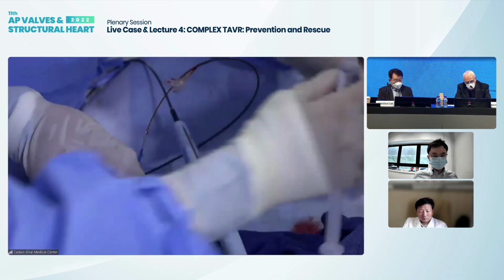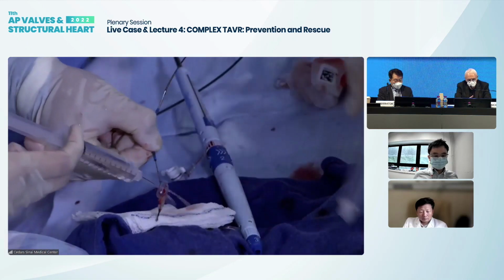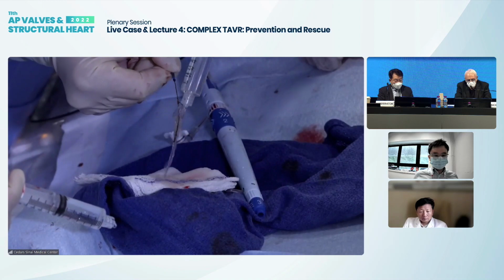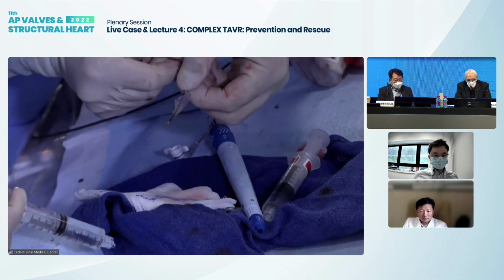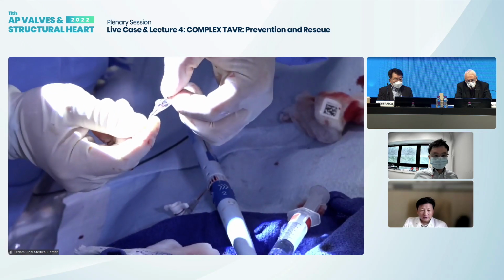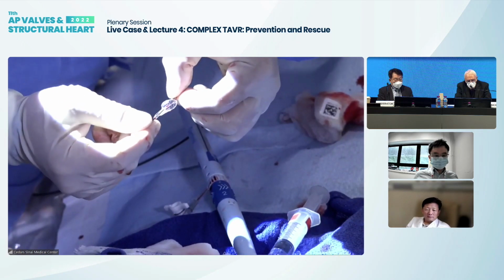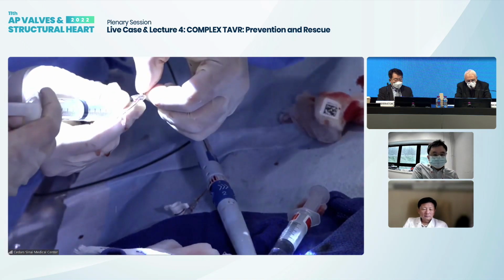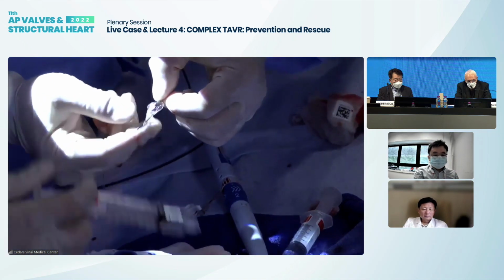The other side. Oh, yeah. Let's see. This side. Better? There is something. Yeah, there's something inside, no? Not sure. Not sure.